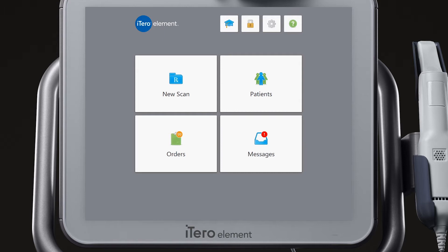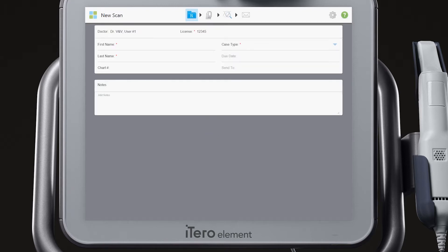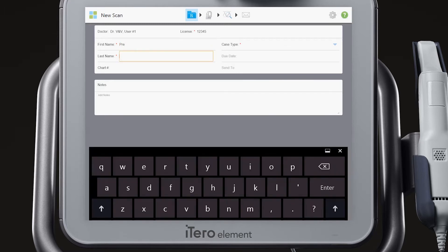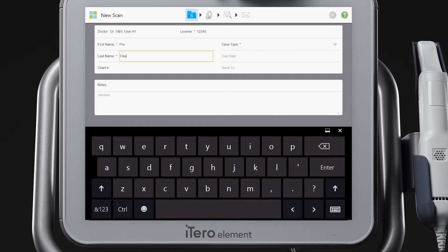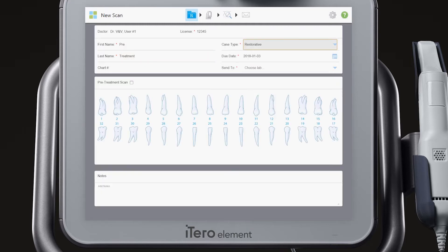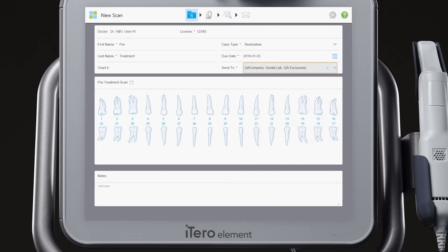Before you begin prepping the anatomy for the restoration, take a scan of the patient's current dentition. To start, select New Scan from the home screen. Complete the required information in the Rx: patient's first and last name, case type, due date, and the lab the case will be sent to. The required items are identified by the red asterisk. Mark the pre-treatment scan checkbox.